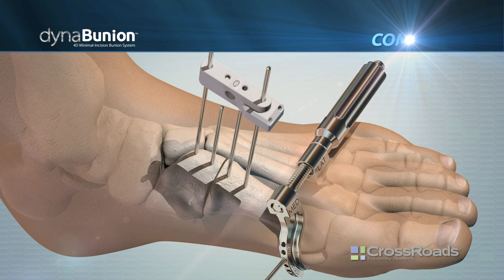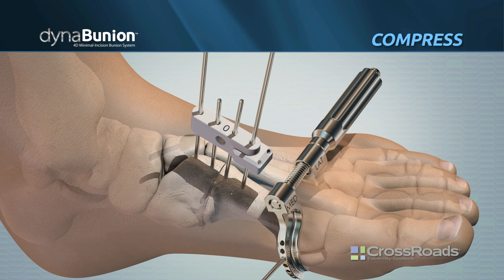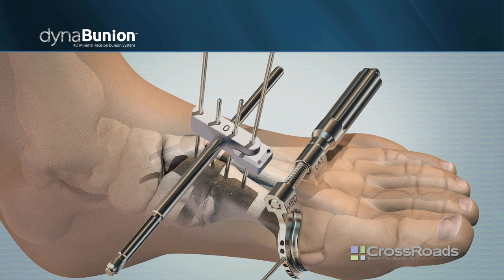Starting with RAC Block 0, align the four dorsal holes of the block over the four dorsal wires with the two angled holes facing distally. Once aligned, the blunt side of the universal handle can be slid into the large hole of the RAC block to provide more leverage. Use the handle to push the compressor block down to the bone.